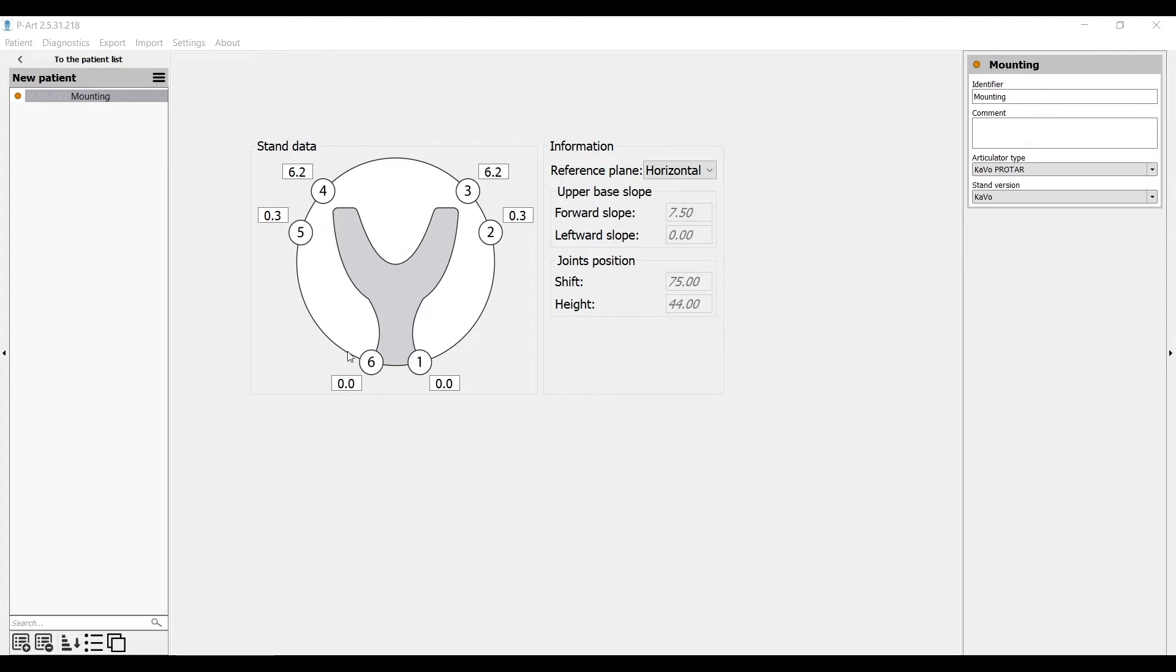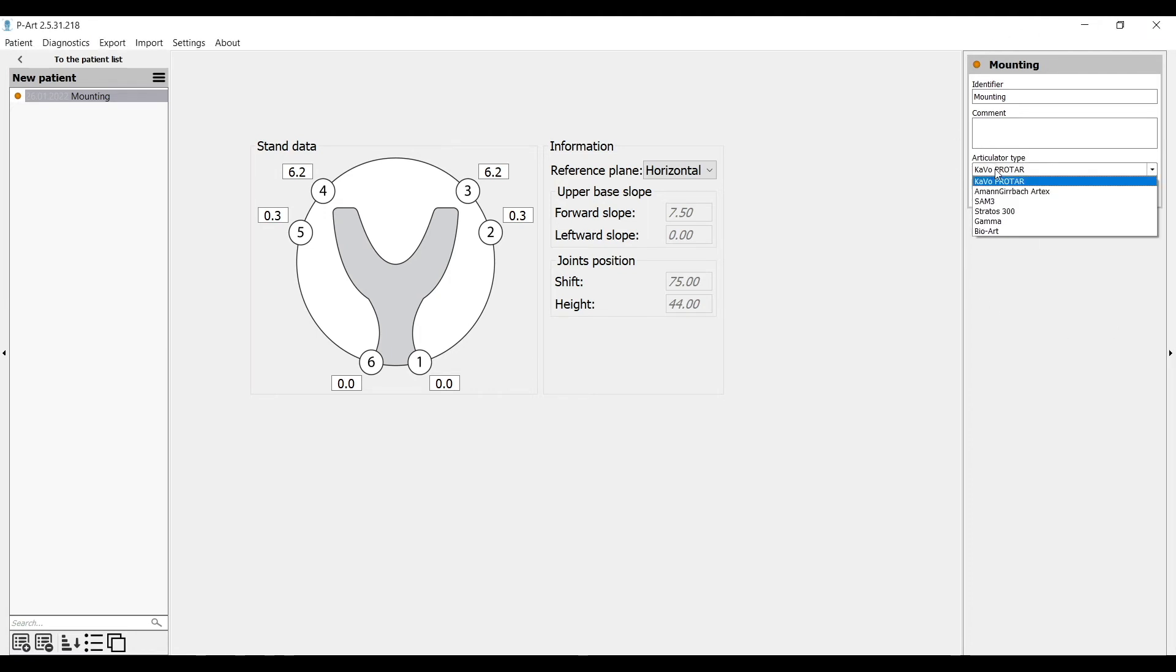For work with it we need to use Digital Facebow. When we get the settings, they are suitable to particular articulator. To choose the articulator we need the right menu and choose the type of articulator you plan to work with. And you will see the changes of numbers.